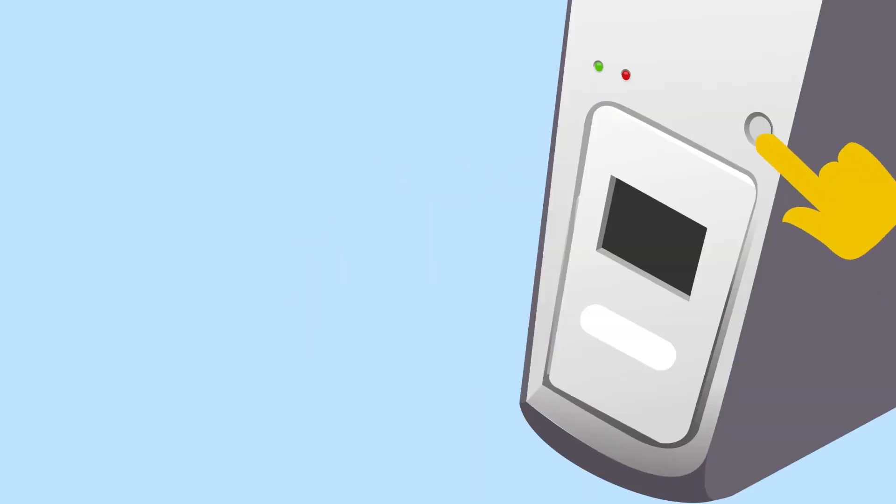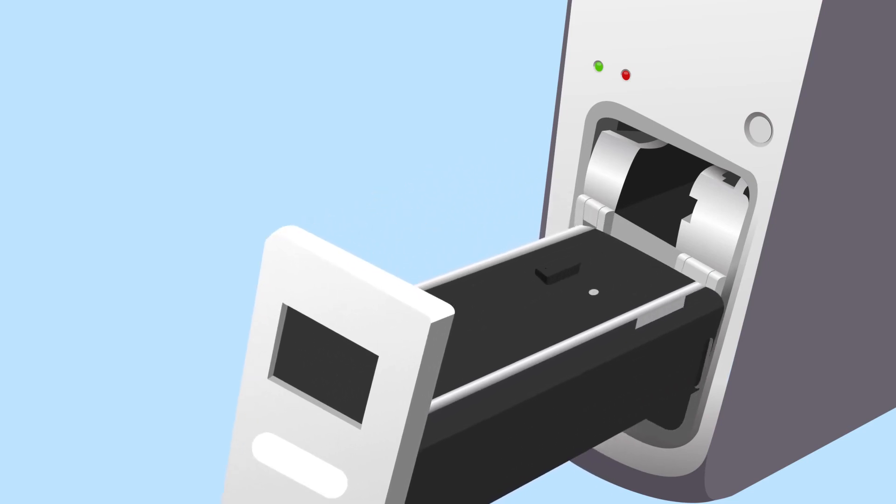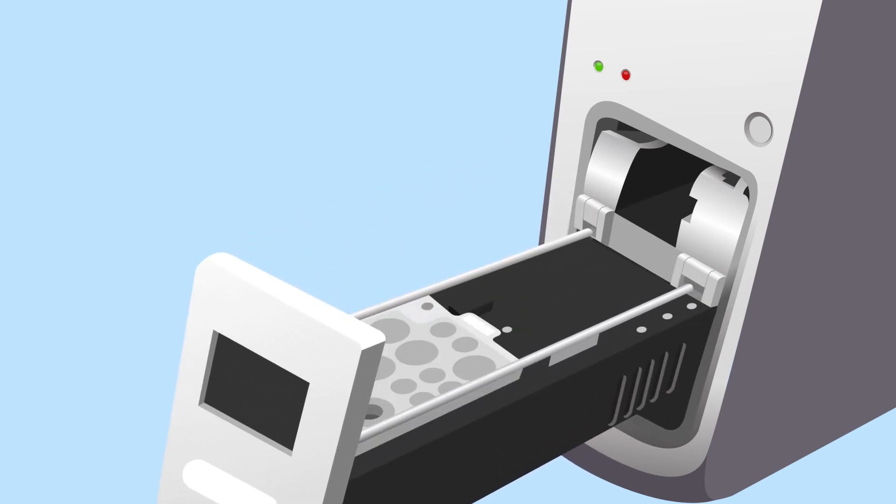To perform a test, open the drawer of the Verigene Processor SP and load an extraction tray, tip holder assembly, and utility tray.